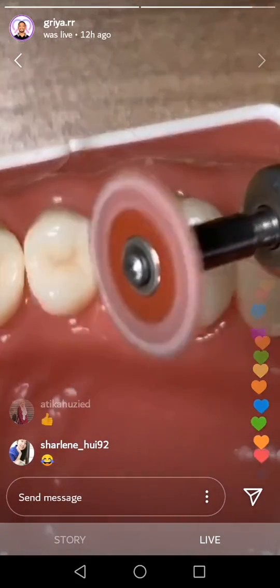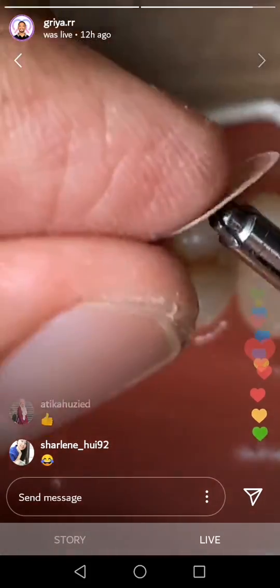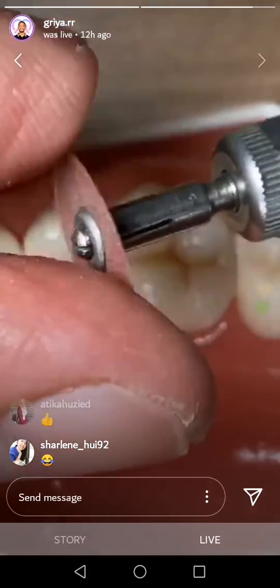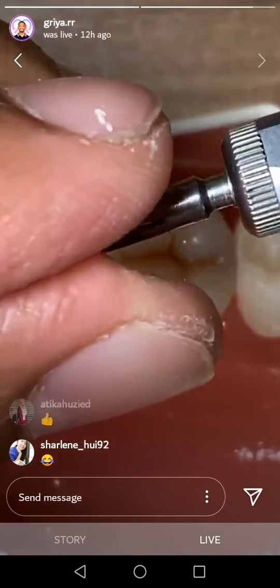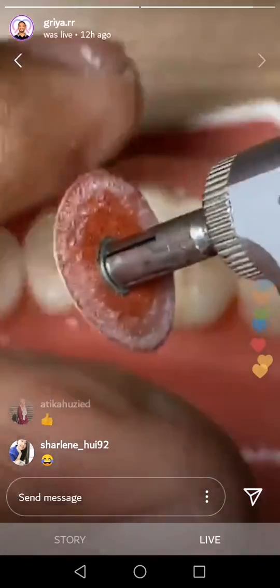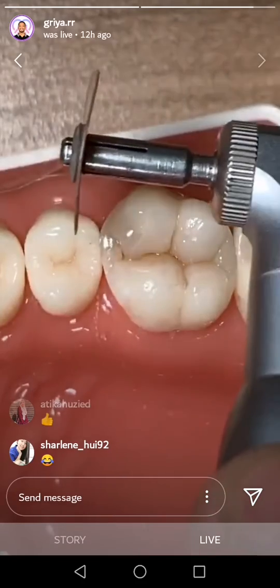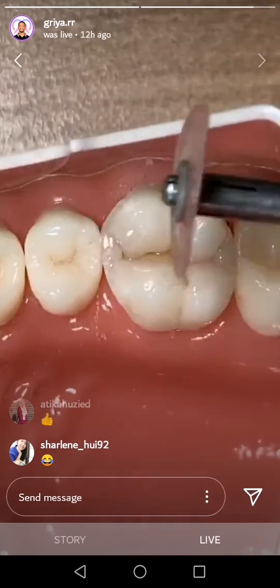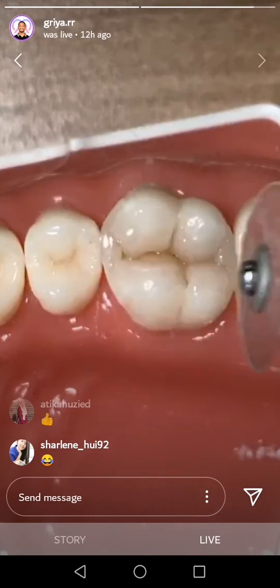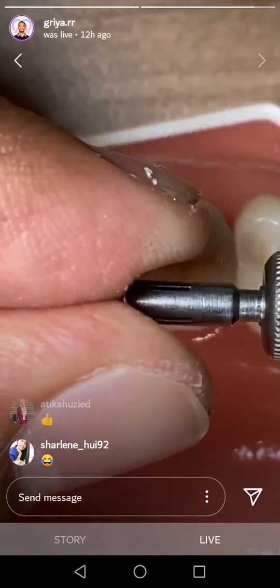Okay, or you can change this to the back side like this, and you can massage here. You can bend it like this to make it a little bit curved. See, like this, curving, so it will follow. Okay, if you see the new one, this is the new one. The new one is flat, and then I bend it like this, bending.